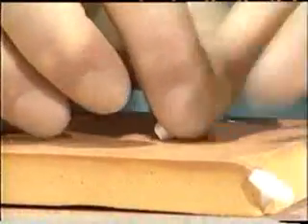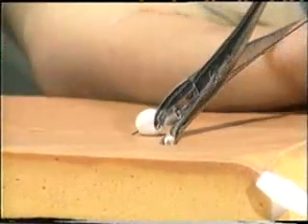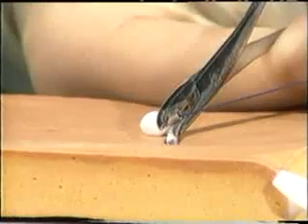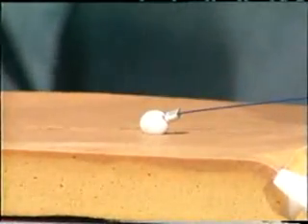Once the closure has been completed, a further bead and cuff are placed onto the suture end, and once the correct tension has been applied to the suture material, the metal bead is crushed using a substantial hemostat or bead crusher. And then the suture is cut.